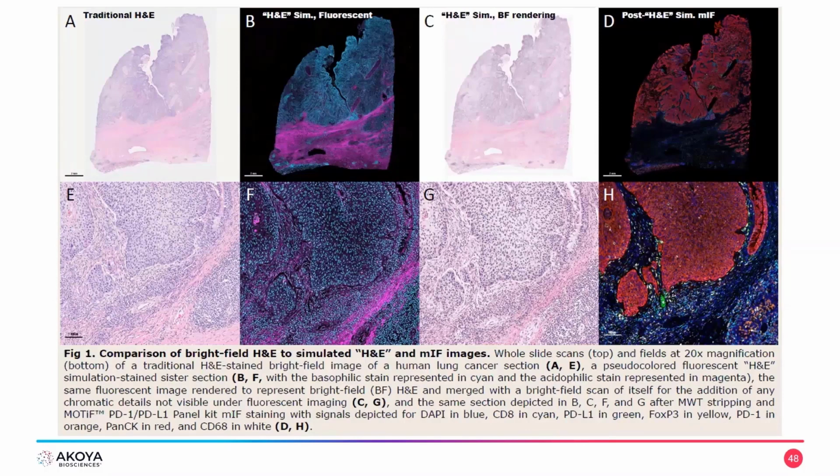And you can adjust the intensities of these things as you would be able to with other fluorescent dyes, retrospectively. And then the monochrome images from this scan have then been converted into a bright field format and colorized to mimic the traditional H&E appearance to the right-hand side there. So those are different versions of essentially the same image from the same scan of this tissue sample.